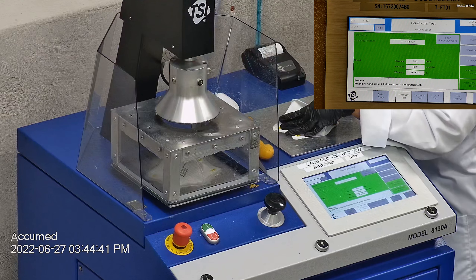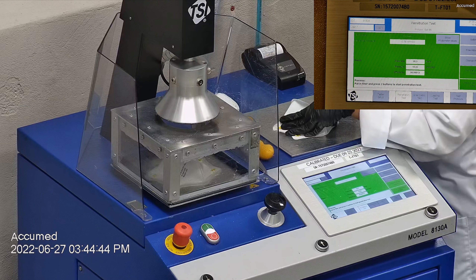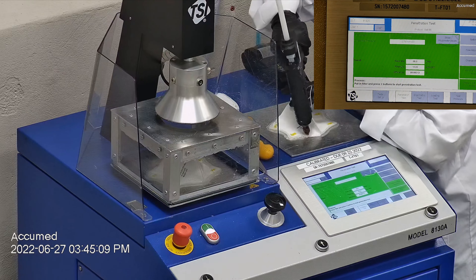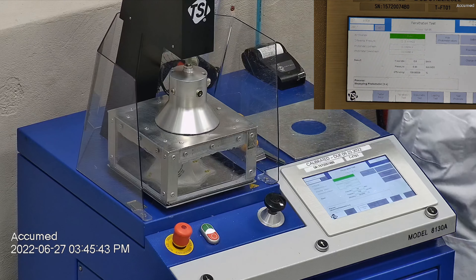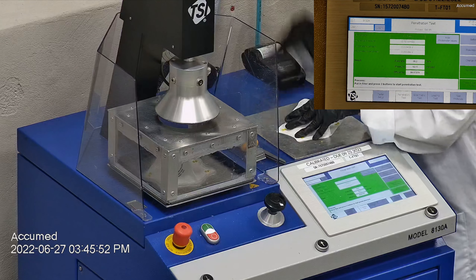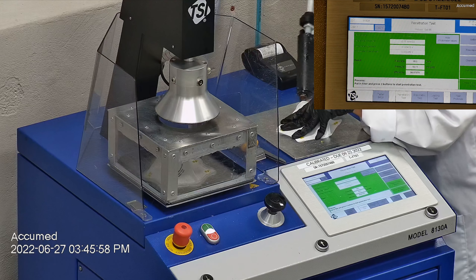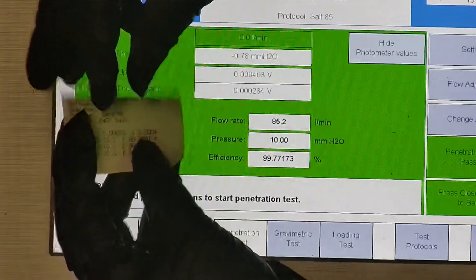The first sample tested at 99.86% filtration efficiency with a pressure drop of 10.2 millimeters of water. The second sample had a filtration percentage of 99.87% and a pressure drop of 10.1 millimeters of water. The last sample's filtration percentage was 99.77% with a pressure drop of 10 millimeters of water.